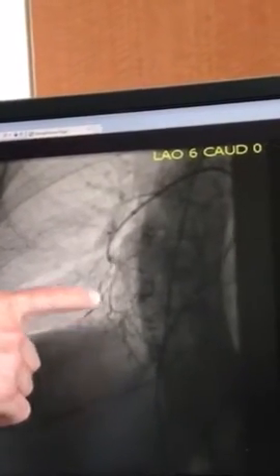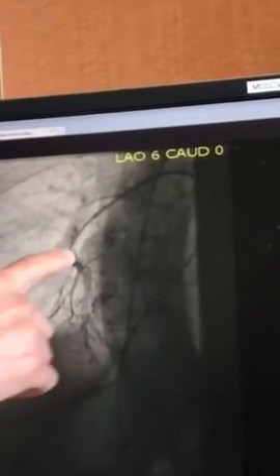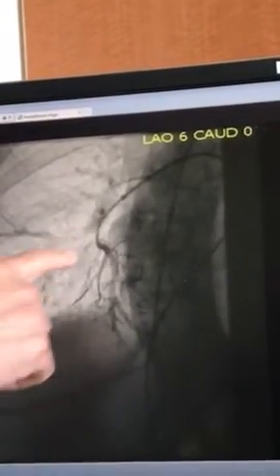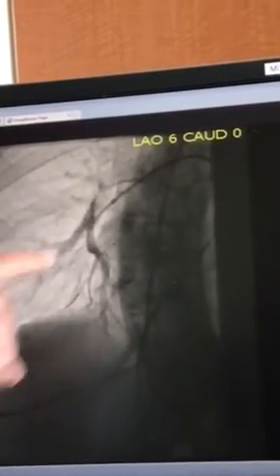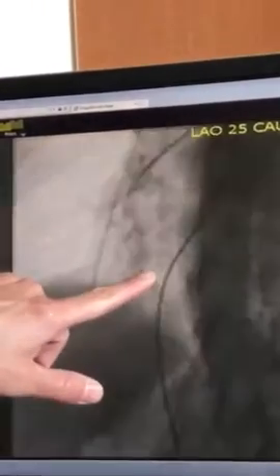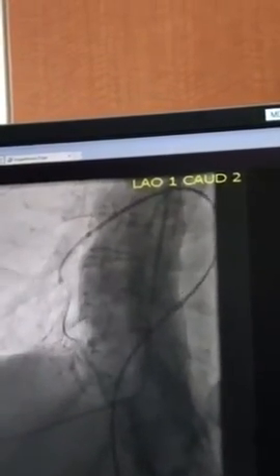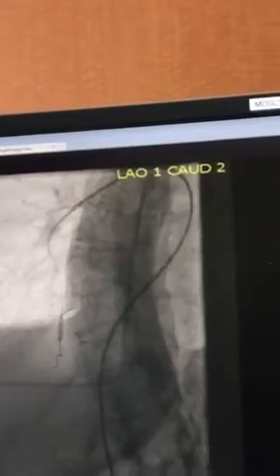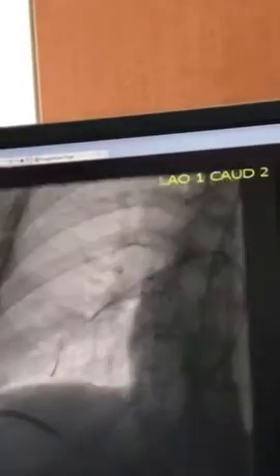I don't know if you guys can appreciate it. It's always easier to see what normal is, but certainly in this vessel, the contrast filling is much more uniform. In this branch, I don't know if you can appreciate how much bigger, without the catheter being even directly engaged in it, how much bigger this is filling, and this is filling as well. And so we basically first started working down this branch. This is a separate little branch of that vessel, and there's a balloon down in the bigger branch and all the way down that one.